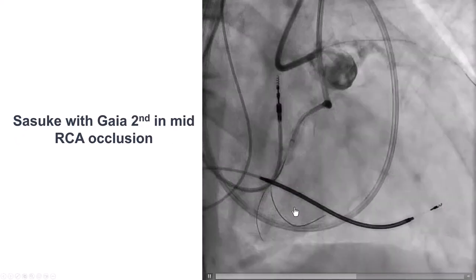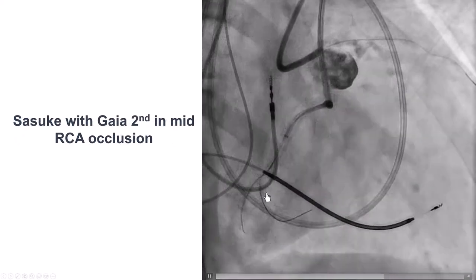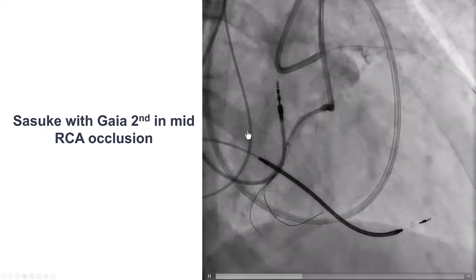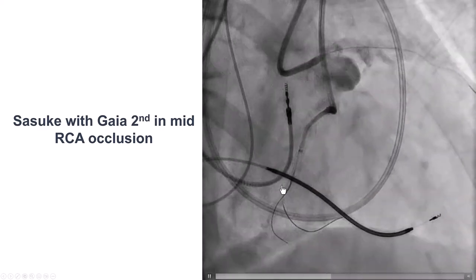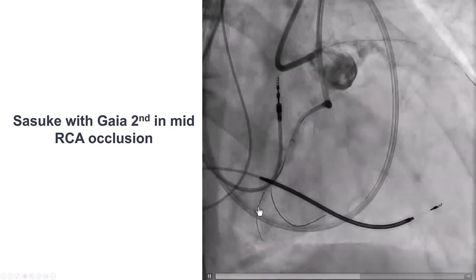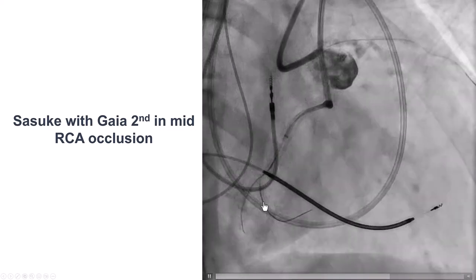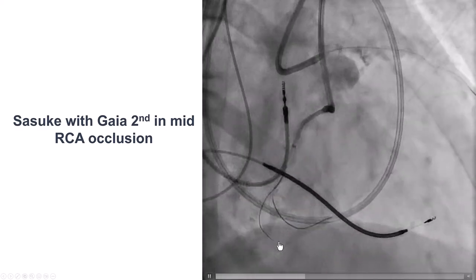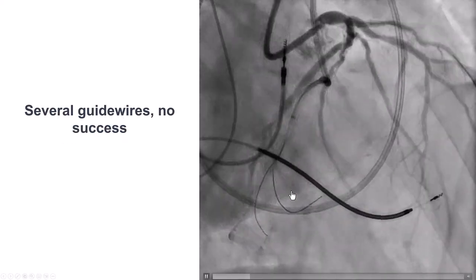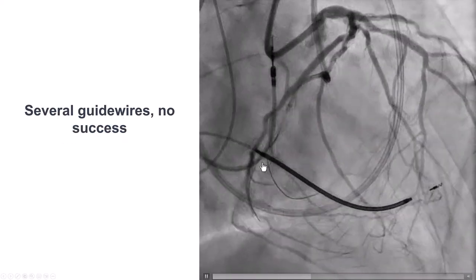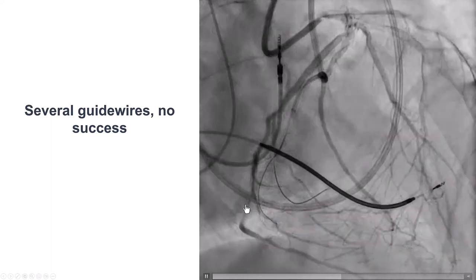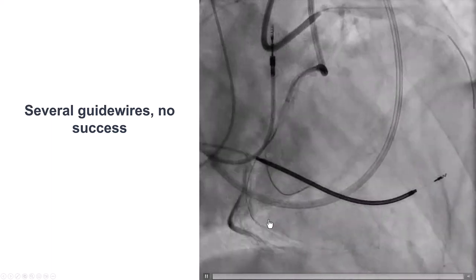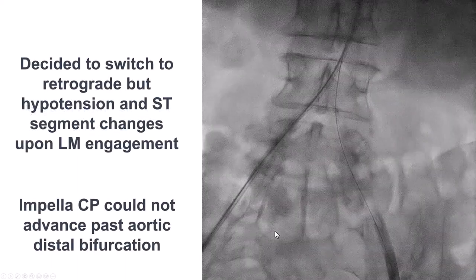So now we have a side branch next to that cap. We used a Sasuke dual-lumen microcatheter and then a Gaia Second wire. Unfortunately, that wire also went into a more distal acute marginal branch. Multiple attempts to redirect the guide wire to go into the distal RCA were made, but unfortunately the wire kept entering into the acute marginal branch.